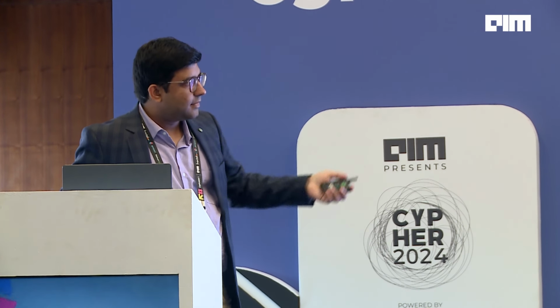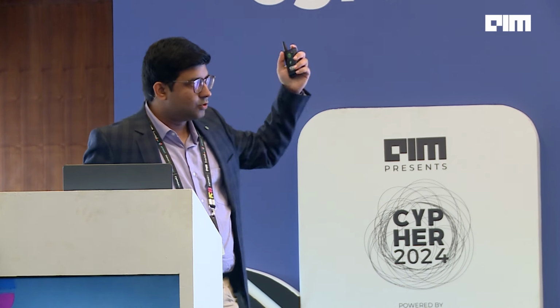And how do we measure? So we have trained this model over this data set. It's standard training, supervised fine tuning. And we trained it over 20 epochs using the foundation model we trained. So I'll show you one of the architectures that I've used. So we used VIT-S. VIT is a vision transformer. It was made for images. We have converted this to work with 1D inputs, which is our ECG.